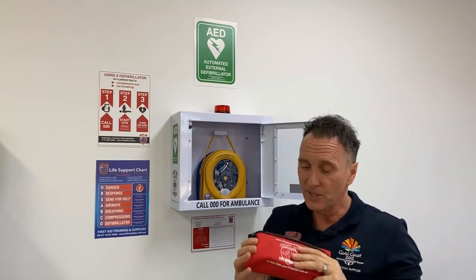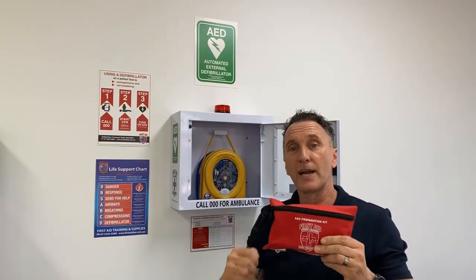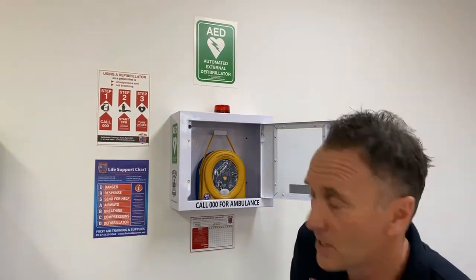We also have the patient prep pack. This is a great addition to this bundle because it helps you prep the patient's chest with shears, a razor, a hard CPR face mask, and gloves, enabling you to access the patient's chest.